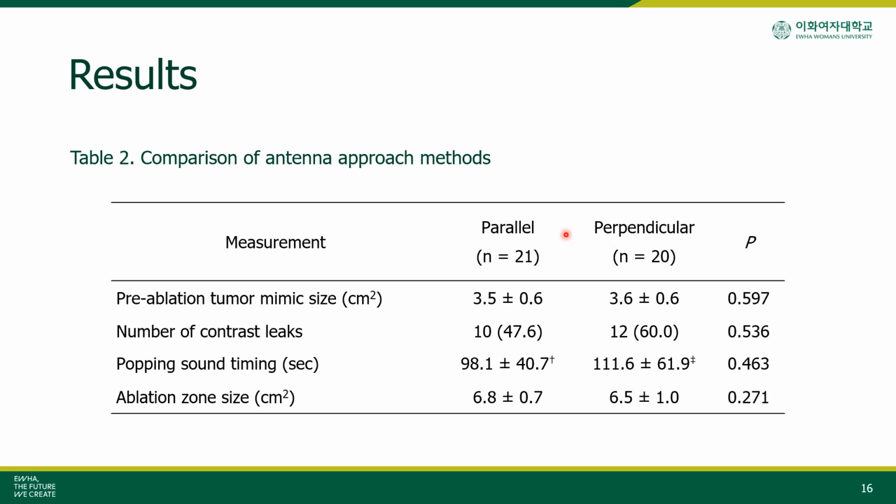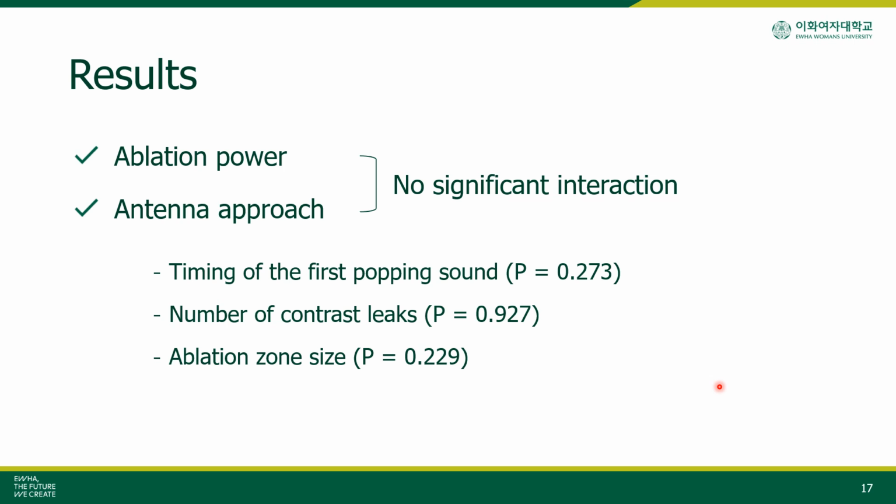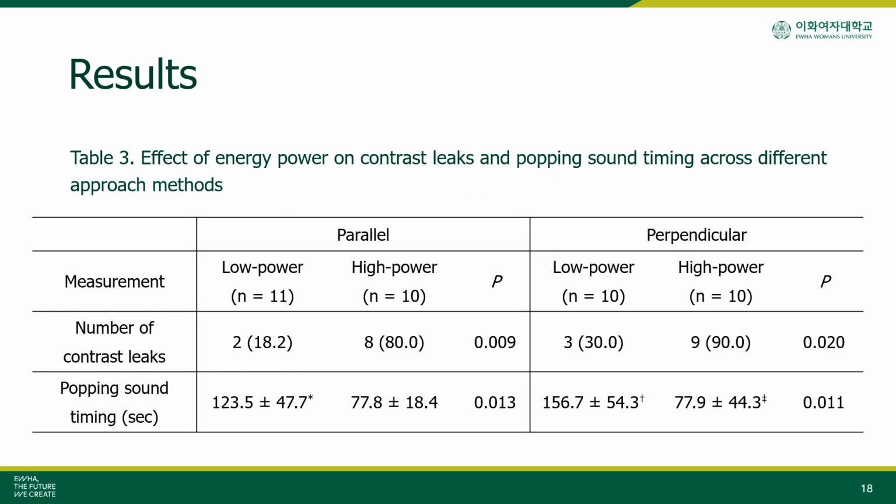In comparison of the antenna approach methods, 10 cases of contrast leaks were observed using the parallel approach and 12 using the perpendicular approach. The popping sound timing and the ablation zone size were not significantly different between the two approaches. There was no significant interaction between the ablation power and antenna approach method in terms of the popping sound timing, number of contrast leaks, and ablation zone size.